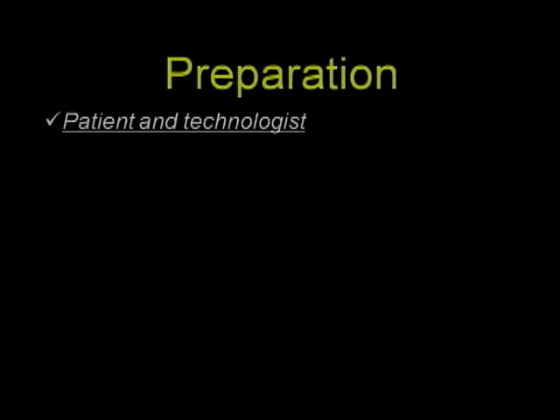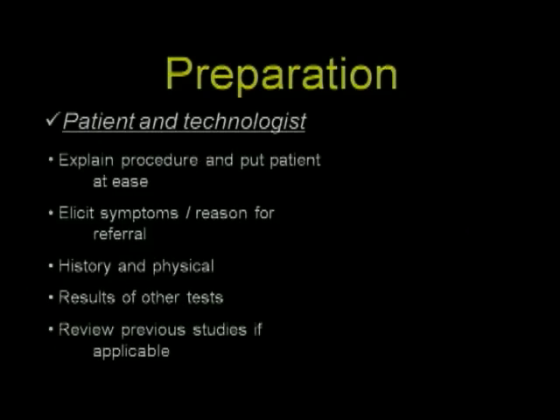Although there's very little preparation involved for the examination, I think the little preparation that there is is important. In my mind, it's important to explain the procedure to the patient and to put the patient at ease. It makes for a much more facile examination.